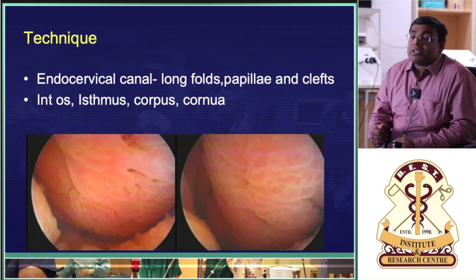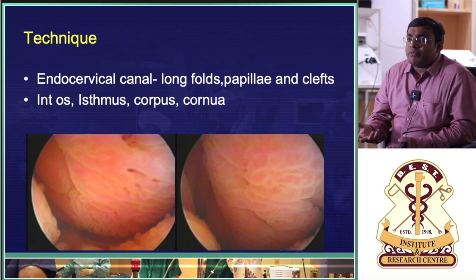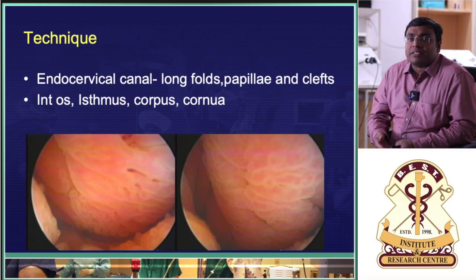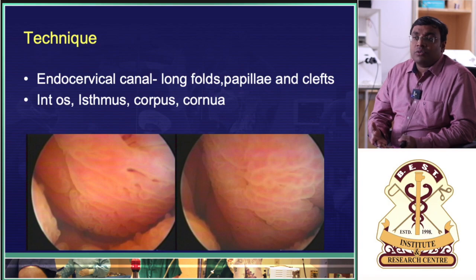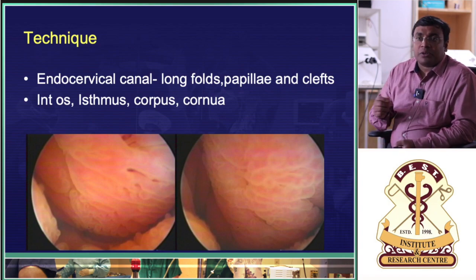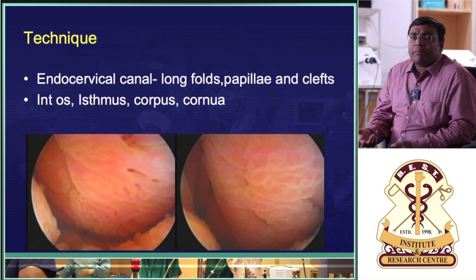If you are a person doing scan for your own patients, do the scan and find out whether it is anteverted, whether it's retroverted. Everything on scan you get to know. To know whether the uterus is anteverted or retroverted, you need not sound the uterus prior to hysteroscopy. You got it? Do a bimanual examination.